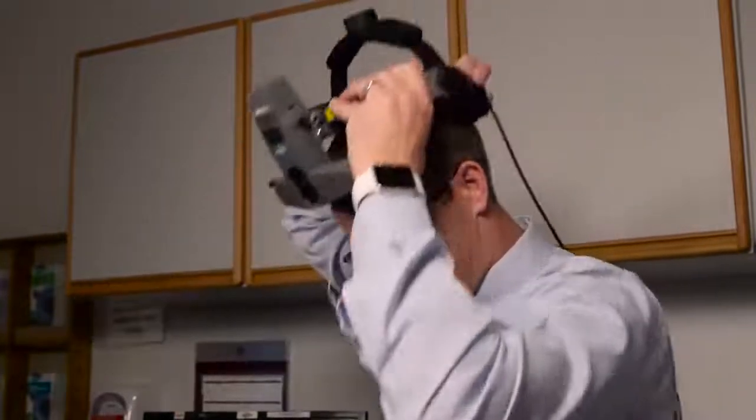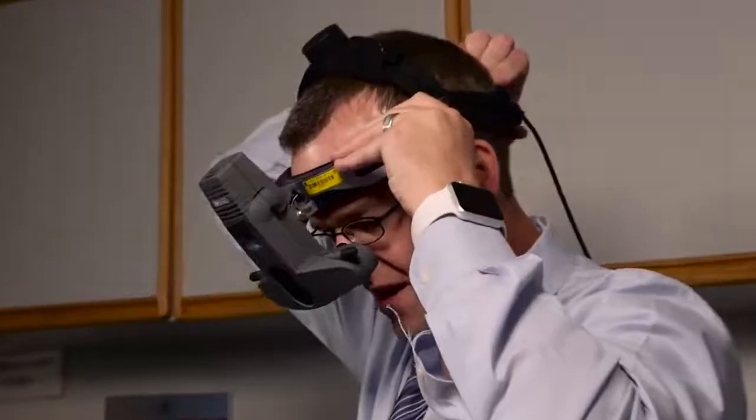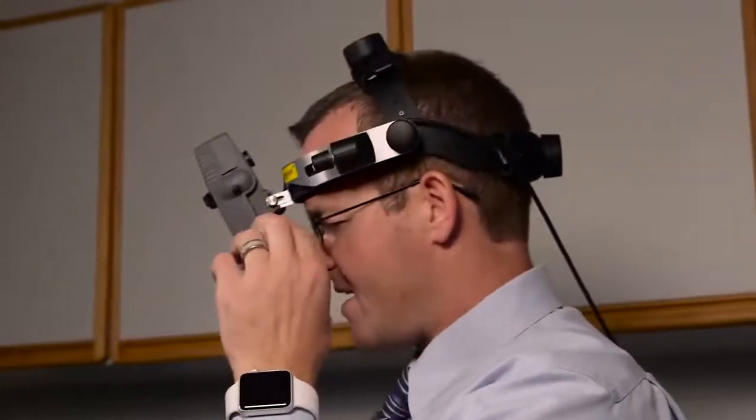In general, you never have to really touch this one. It's usually set right, and you just tighten and untighten it to get it onto your head. So I just turned it counterclockwise, which loosens it, and then I'll turn it back clockwise to tighten it. The two eyepieces are set correctly. They're about level with my eye, if you can see that.